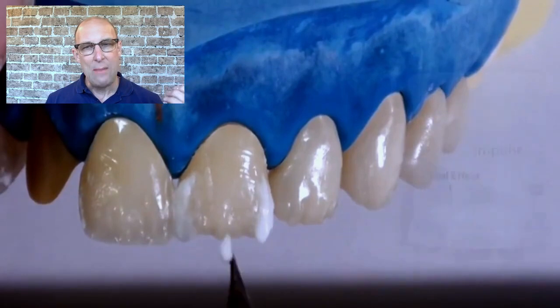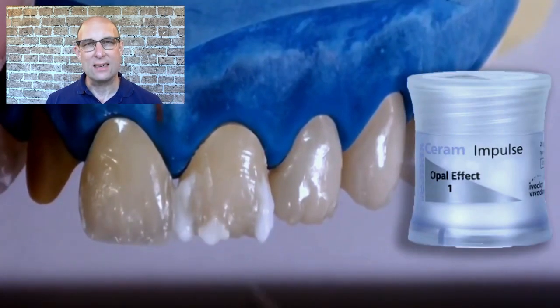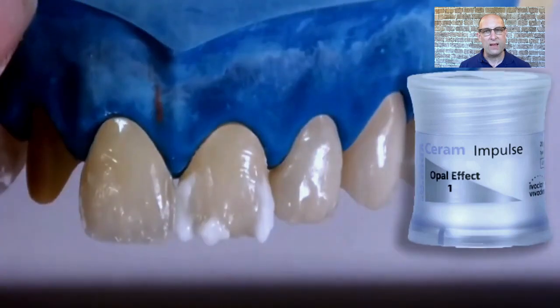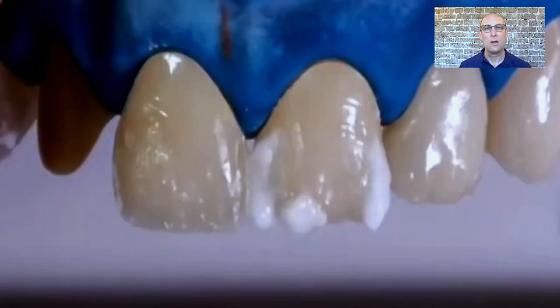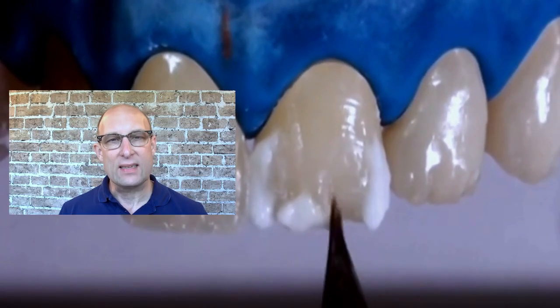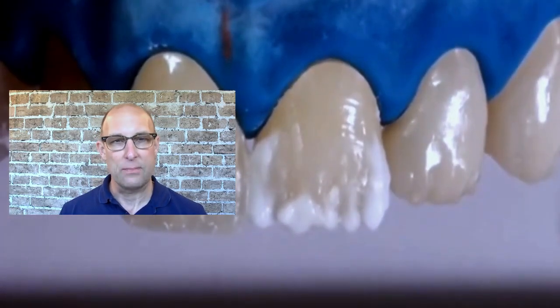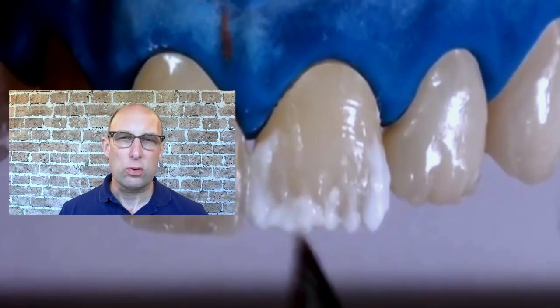To create a translucent incisal edge, I'm adding OE1 from Ivoclar, which is a very translucent opalescent material. In the Ivoclar ceramic system you have OE1 through OE5 — the higher the number, the milkier white the porcelain becomes. OE5 is an exception: it's more orange-looking and can be used for secondary dentin. Again, the OE1 is built up towards the incisal and not facially outward, since we're adding other materials on top later and don't want to end up too protrusive.